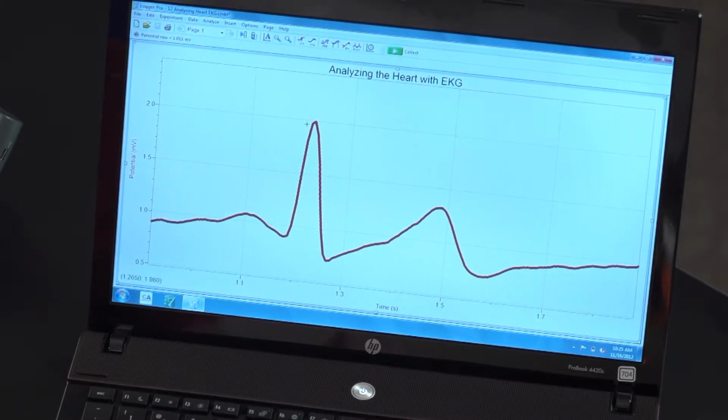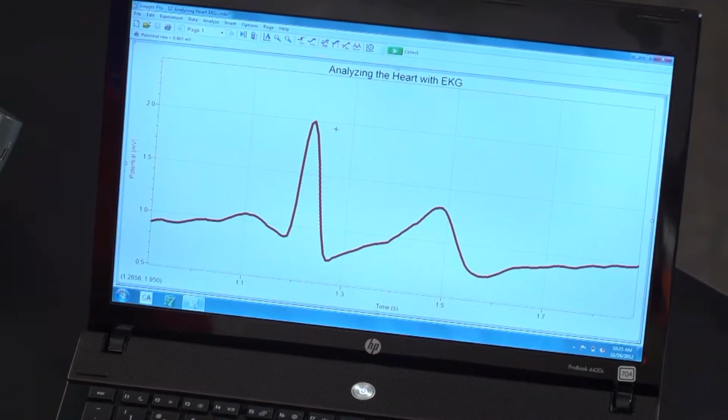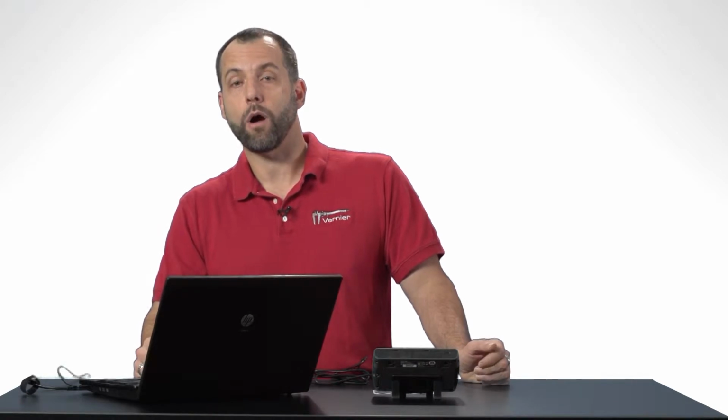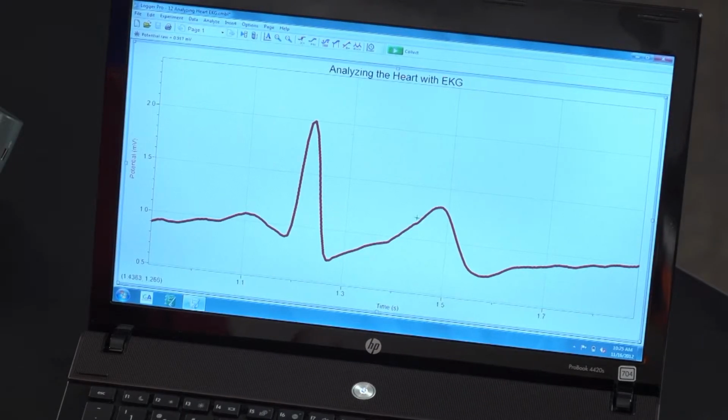Now what you can see in this EKG trace is this little bump right here is called the P wave. And that is the depolarization of the atria of the heart. This large peak here is called the QRS complex. That is the depolarization of the ventricles. Once the ventricles have been depolarized, then the heart can actually pump blood. The heart then needs to repolarize. And that is this part here, which is called the T wave.